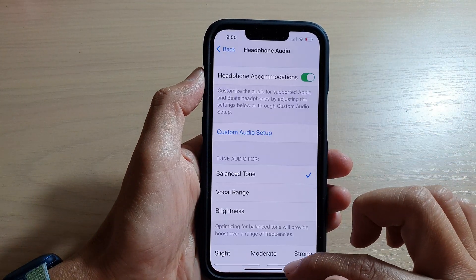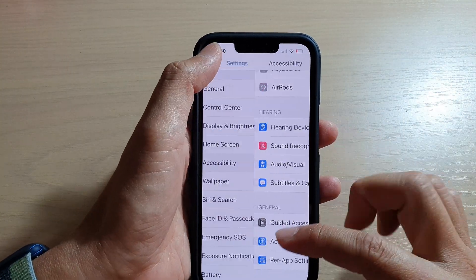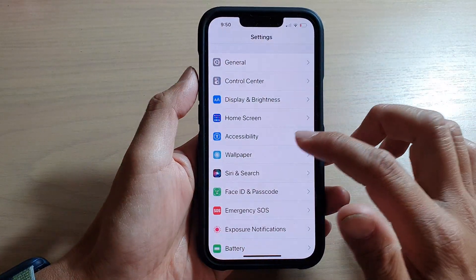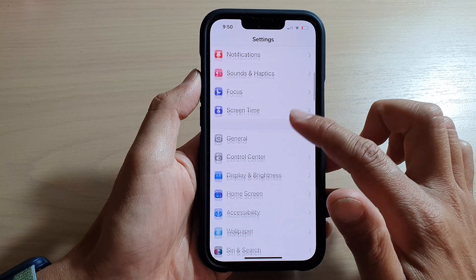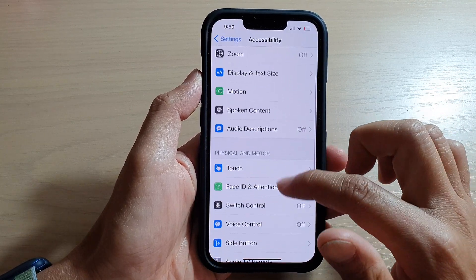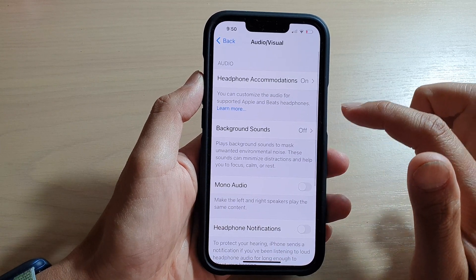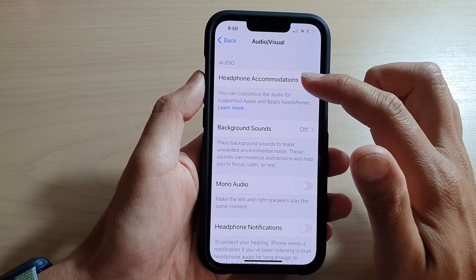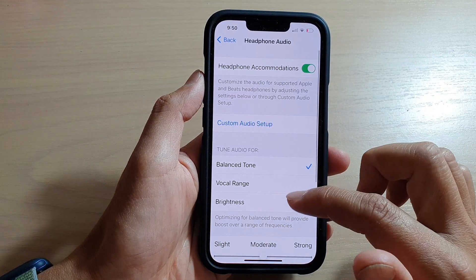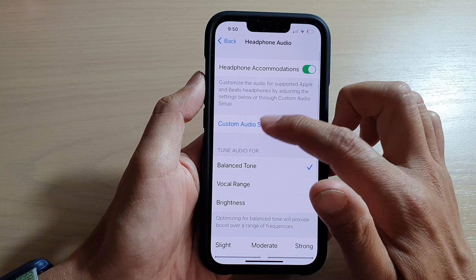First, go back to your home screen by swiping up at the bottom of the screen. On the home screen, tap on Settings. In Settings, tap on Accessibility, then go down and tap on Audio/Visual. Here you want to tap on Headphone Accommodations, then go down and tap on Custom Audio Setup.